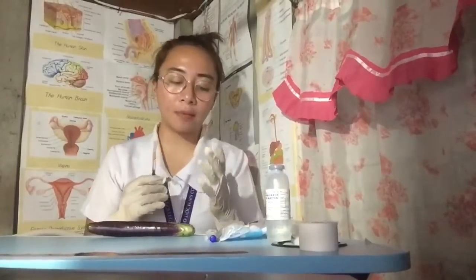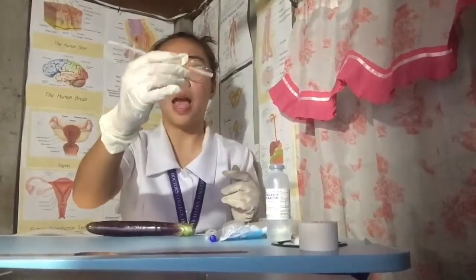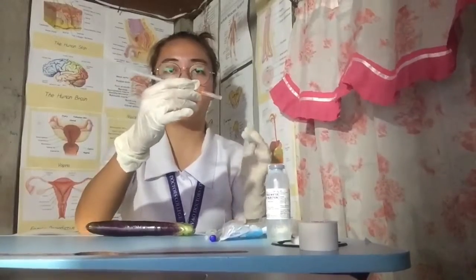So inject the medication by the Z-track technique, and use the ulnar side of the non-dominant hand, and displace the skin approximately 2.5 cm or 1 inch. Use a smaller amount of tissue for an emaciated client or an infant. And now holding the syringe between the thumb and fingers as holding a pen, like this. And pierce the skin smoothly at an angle of 90 degrees.